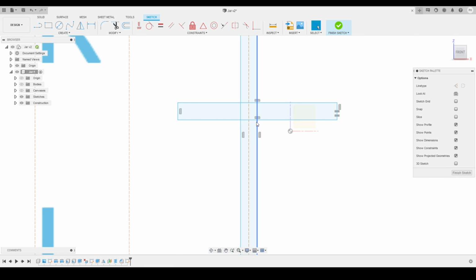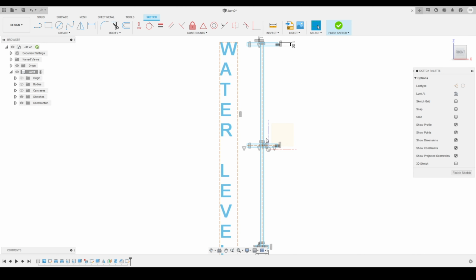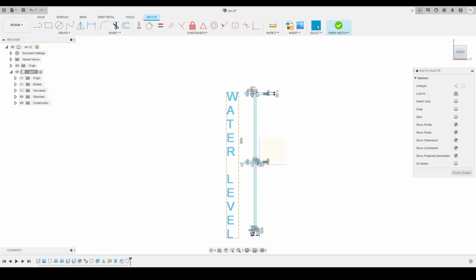This one also I want to be at the midpoint of this line, so I had converted that line to a construction line. Then we'll apply the midpoint constraint between these two lines, so it is on the midpoint, and we'll repeat the process for the top as well. So we'll follow the same process. We'll select, apply the constraint between the line and this line to make a midpoint constraint.